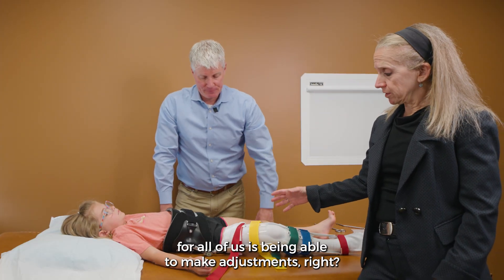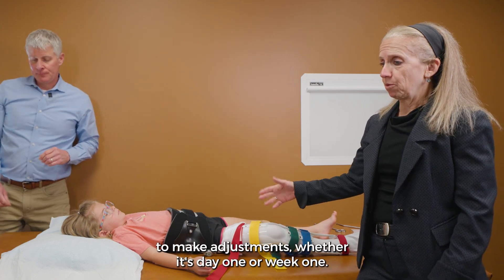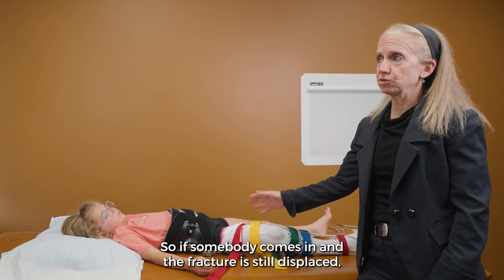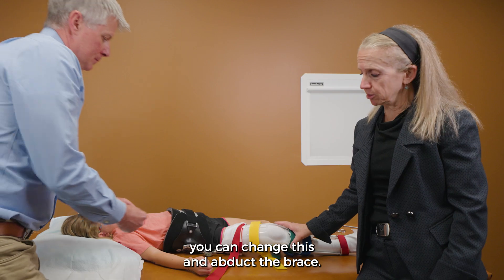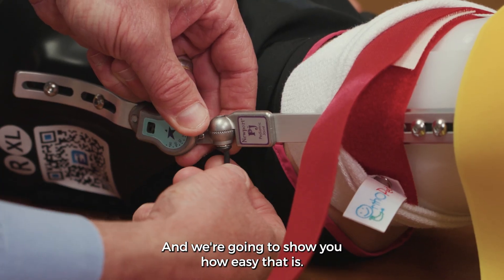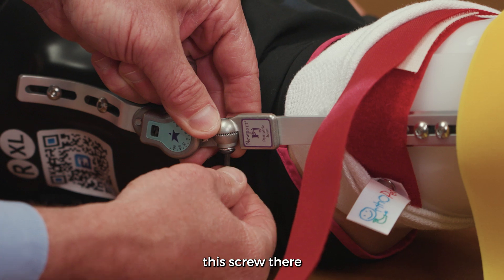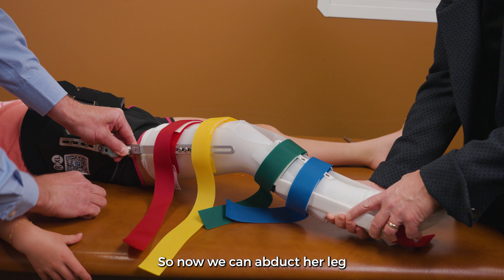The benefit of this brace is being able to make adjustments whether it's day one or week one. So if somebody comes in and the fracture is still displaced, you can change this and abduct the brace. We're going to show you how easy that is — you just loosen the screw there and then you're able to change the angle.